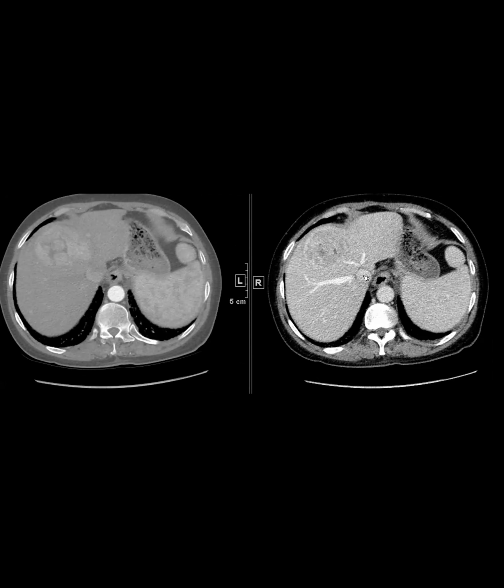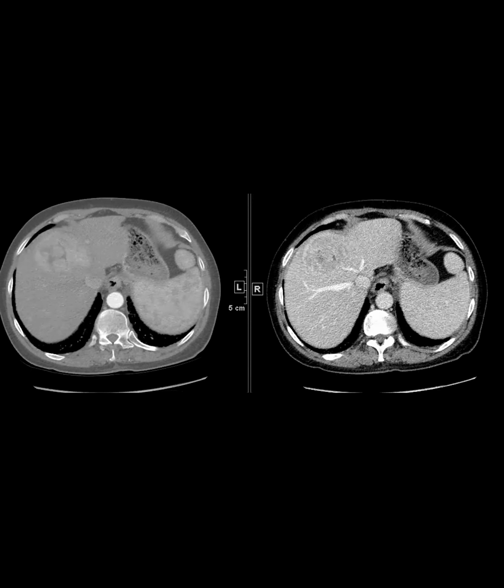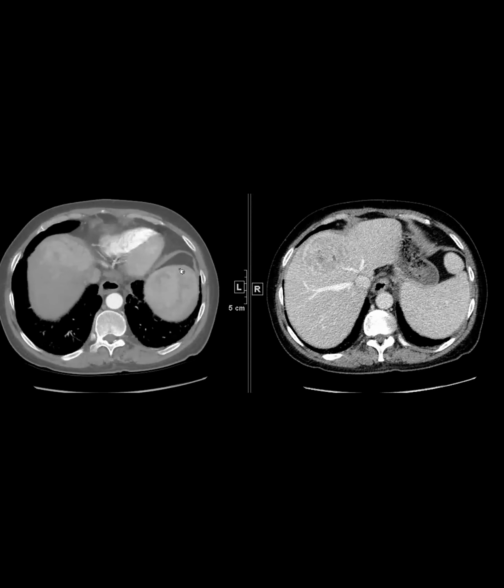So they were very lucky, on more than one reason. Yes. So this is more of an interesting case of natural progression of HCC.